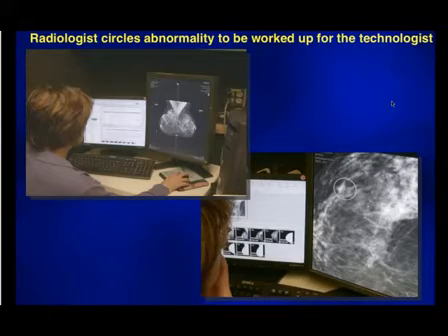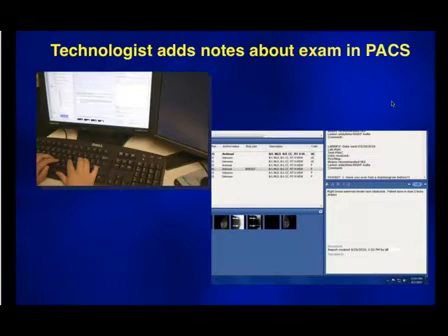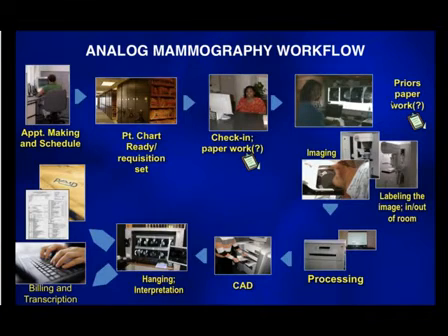And the tech immediately gets the answer of what she wants, what you want her to do. Immediately, no time lost whatsoever. And at the same time, once she gets these images and she's obtained the study, she can type in a note directly back to you on the PACS system to tell you exactly what she did or what she found, so that, again, there's no lost time in communication between you and the technologist. Tremendous advantage to digital in terms of workflow.